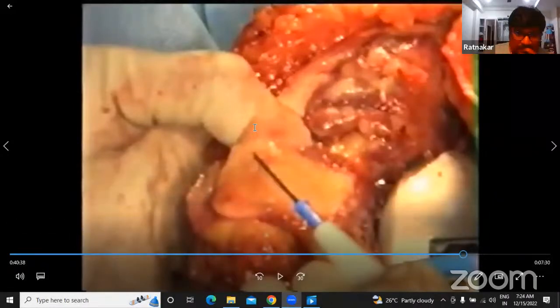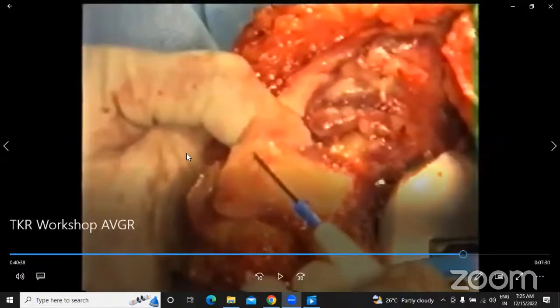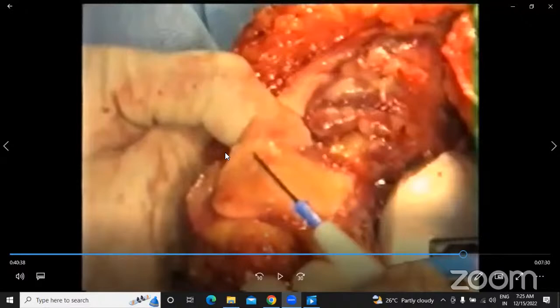Sir, while checking this patellar tracking, it has happened with me twice that the patella is going slightly out. If I place one thumb, it tracks, and when I sutured and repaired the medial side, then the tracking was not good. So, is it normal, or should I have done some check while setting the femoral rotation cut?